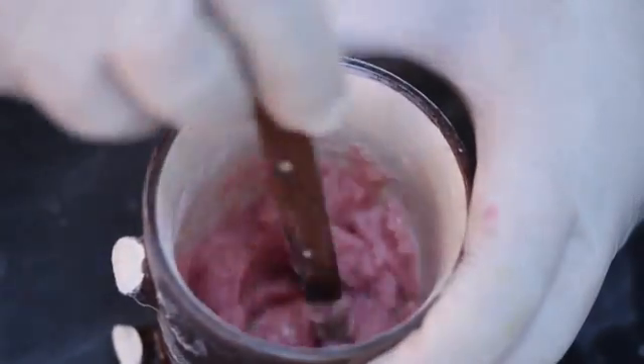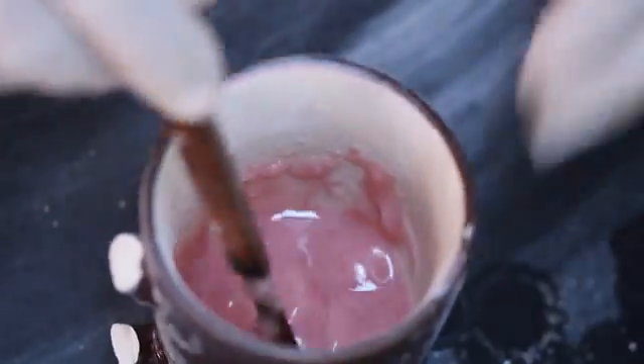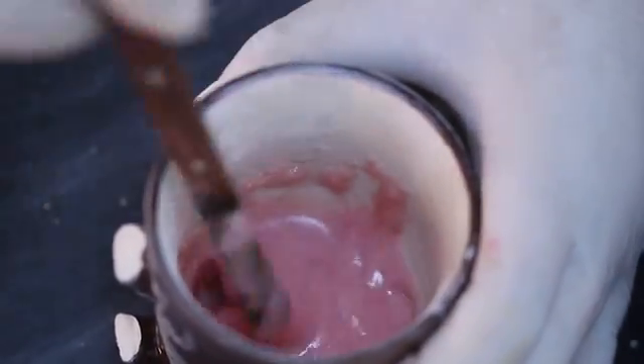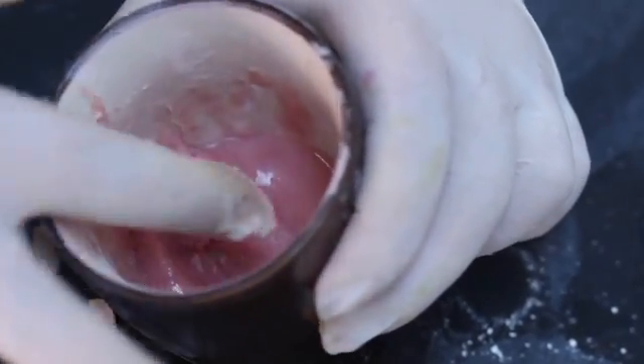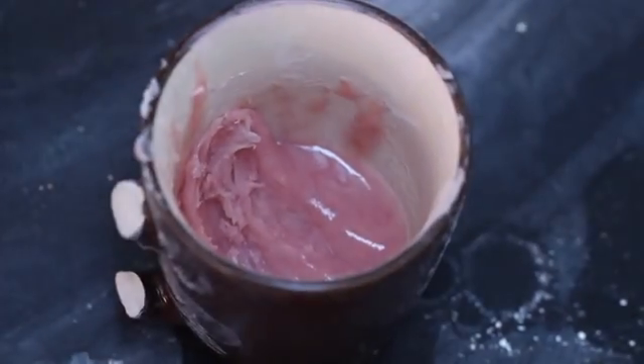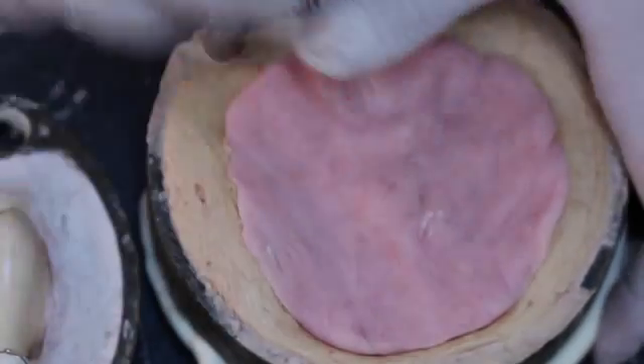Apply resin monomer on the clasps. Manufacturer's recommendations for mixing should be closely followed. The polymer-monomer ratio is usually 3 to 1 by volume. Components are measured and mixed for 30 seconds, or until the polymer is thoroughly wet with the monomer. Cover the mixing jar and check the resin every 30 seconds until it reaches a dough-like consistency. At this point, the resin should separate cleanly from the walls of the mixing jar, and when pulled, the material should snap apart. Upon reaching this stage, the resin should be introduced to the mold.